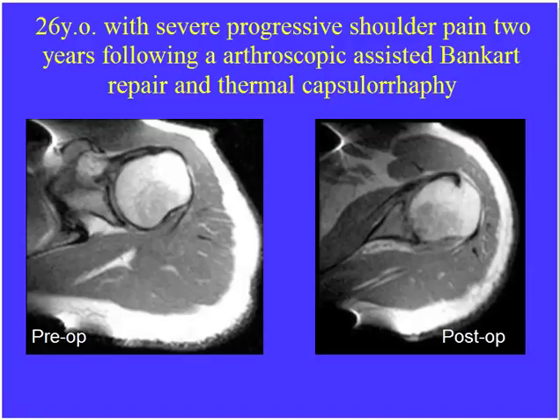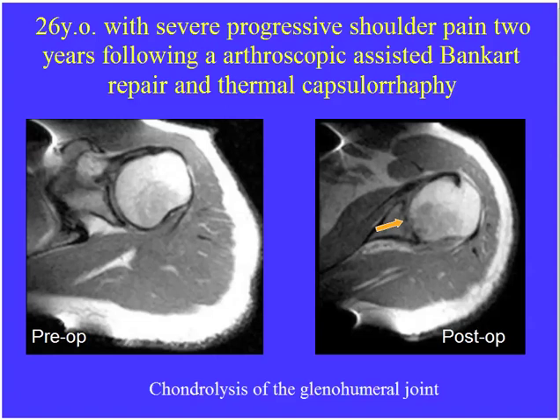A 26-year-old with progressive shoulder pain following arthroscopic Bankart repair and thermal capsulorrhaphy. Preoperative study shows normal articular cartilage and normal subchondral marrow. Two years later with persistent pain and decreased range of motion, we see complete loss of articular cartilage and subchondral marrow signal changes — severe osteoarthritis. This is severe chondrolysis of the glenohumeral joint following thermal capsulorrhaphy.